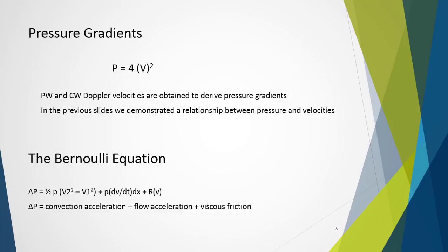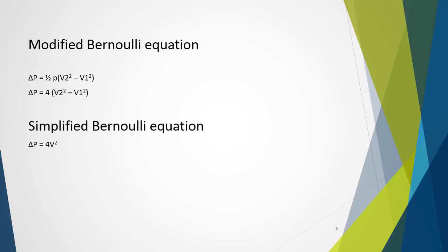Now fortunately this can be simplified. We are investigating peak flows, thus acceleration is effectively non-existent at peak. Blood velocity and blood viscosity influence viscous friction. These play a negligible effect when the orifice is greater than 0.25 centimeters squared, pretty much everything cardiac. And thus this can be ignored as well. This just leaves convective acceleration. Thus we have a much more manageable calculation now.